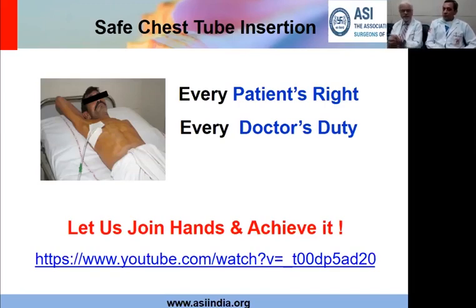You have nicely mentioned how to fix the tube, and I think this is very crucial. But we have seen instances when the tube has slipped out within a day of its insertion because it was not properly fixed. In that situation, what would be your advice? Yeah, so the advice would be, suppose the patient is being shifted somewhere and somehow the tube gets inadvertently pulled out. The resident or the nurse, whoever is there, their first response, the reflex, should be to take a sterile gauze piece or cotton and just block that hole and put an occlusive dressing.